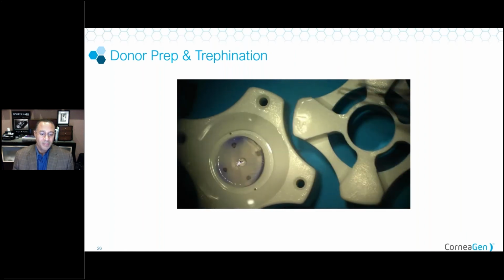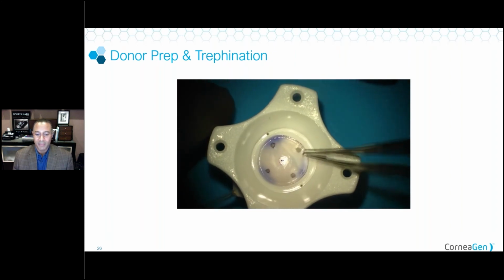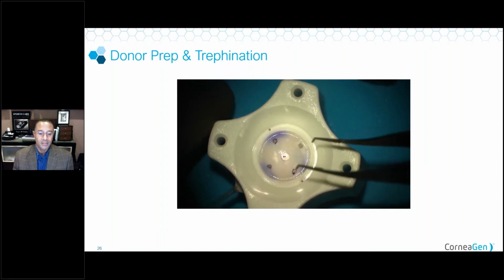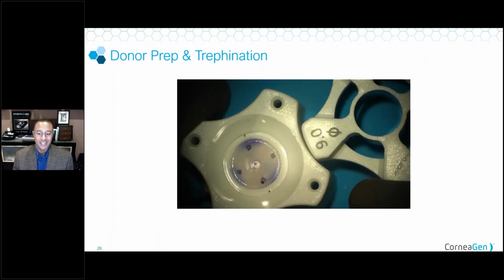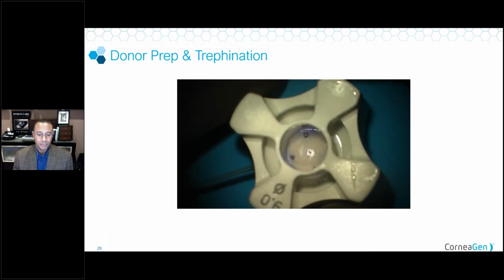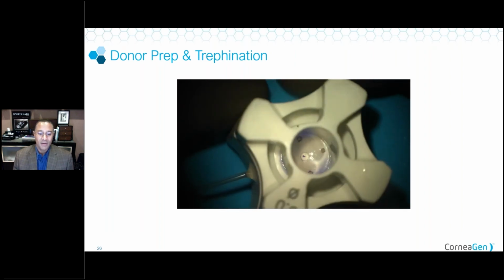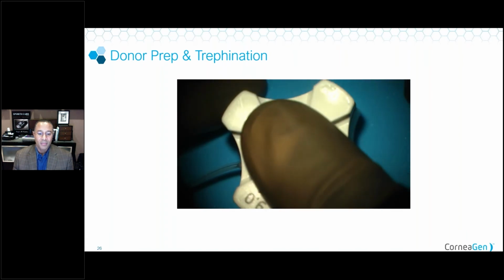Now, we don't have to commit to our center dot there. If our center dot is off a little bit, sometimes I have good days, sometimes I have bad days. What we really want to concentrate on is where those 4 holes are relative to the edges of our graft. We want to try to keep those even, and that's really going to dictate what our center is. I reconfirm that I've got a 9. Although our donor said that it was exactly a 9, we can see that that sticks out from the edges, and I usually verify that those edges are all the way around and then punch out the 9.